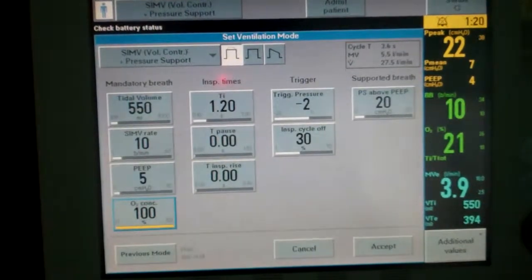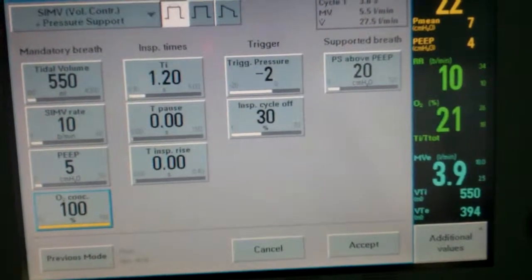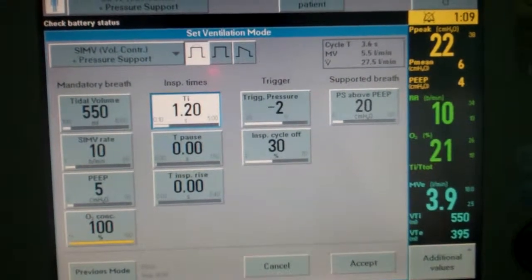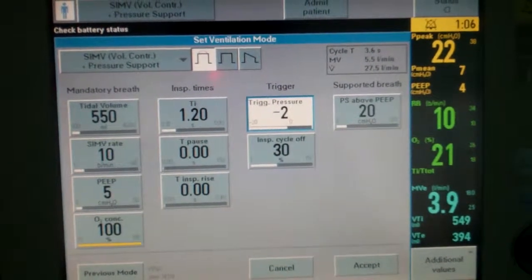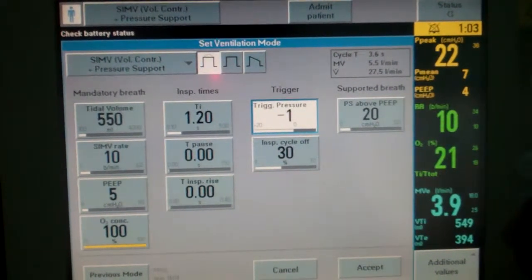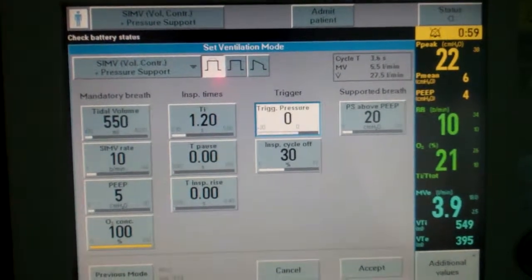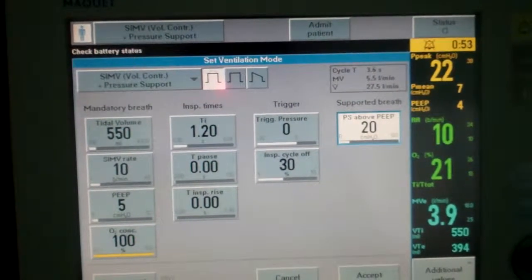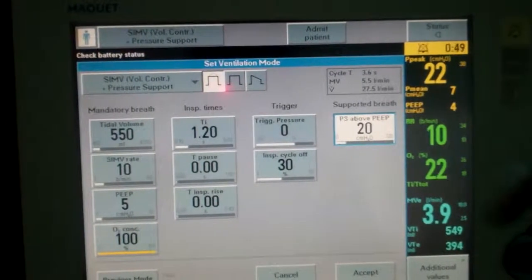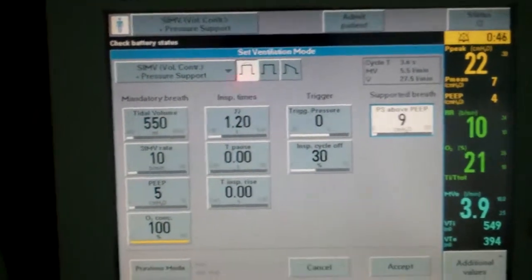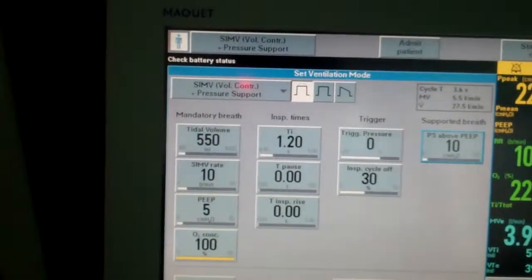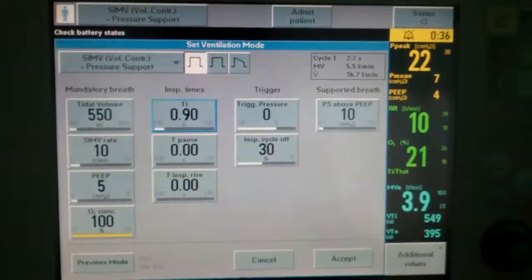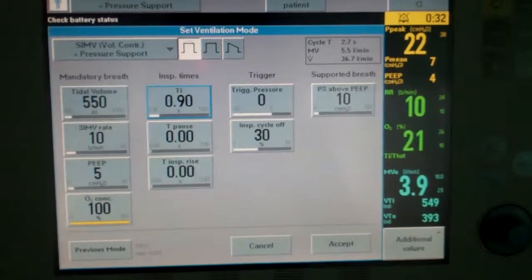These are already defaulted settings, but once you assess the patient and see their graphs and flows, you can start changing the inspiratory time or the trigger. Decreasing the trigger will allow the patient to be more sensitive and have more synchrony with the ventilator. It's always good to add pressure support to the spontaneous breaths — we will set it at 10. We will set inspiratory time to 0.9, which is usually a default setting that can be reassessed later.